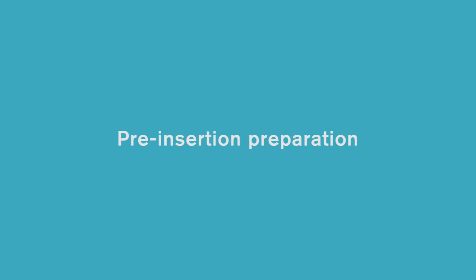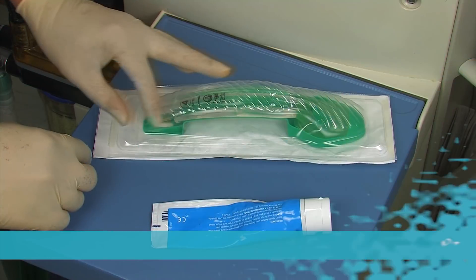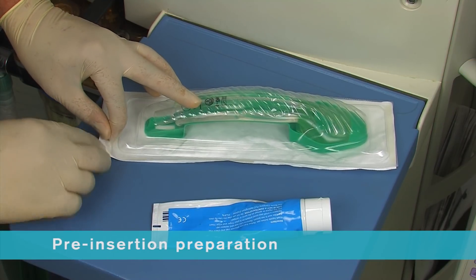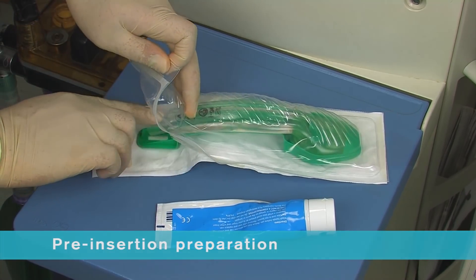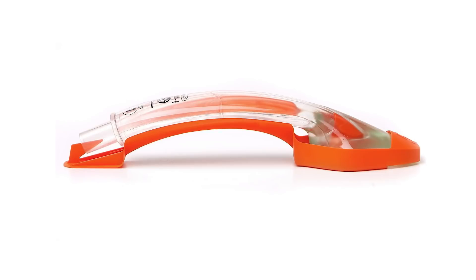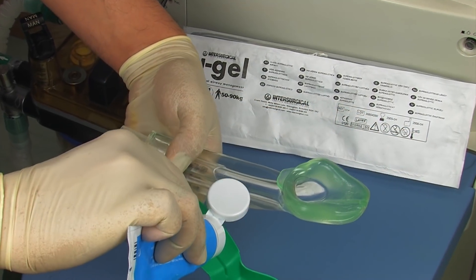Pre-insertion preparation. iGel is supplied in a sterile pouch enclosed in either a protective cradle or a cage pack. This innovative packaging is colour coded for size and designed to ensure the device is maintained in the correct flexion prior to use. It also acts as a base for lubrication.